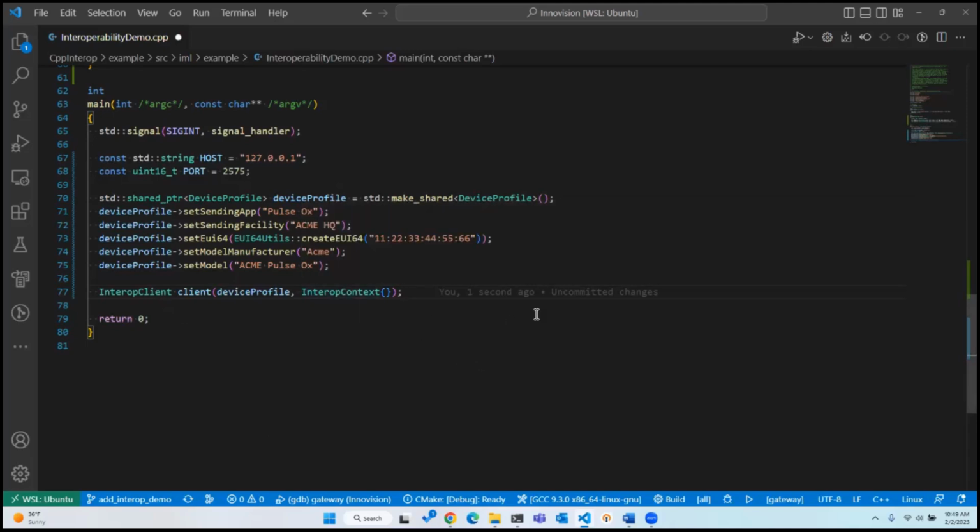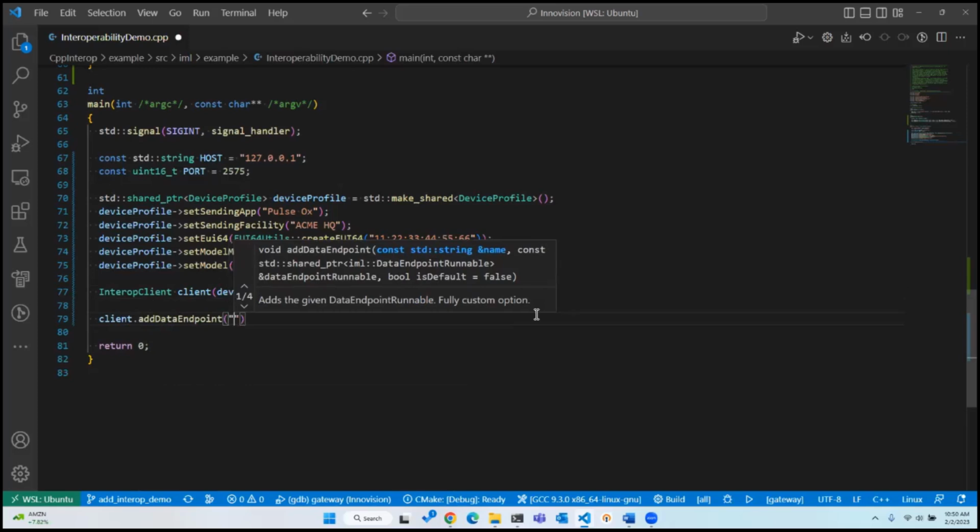From things like, as I said, the networking sockets, all the way to our messaging APIs, so how messages are created or parsed, and also including our data endpoints. A data endpoint, as we will see now, is how you actually define who you're going to talk to. Let's do that. I want to talk to the super EMR.